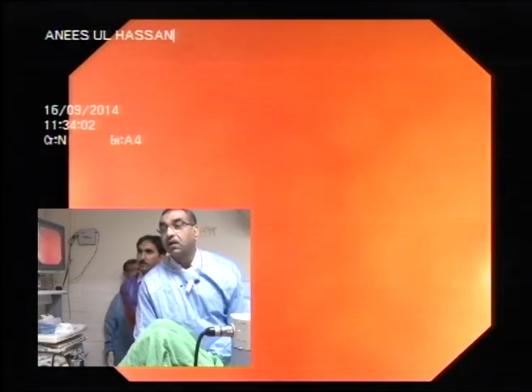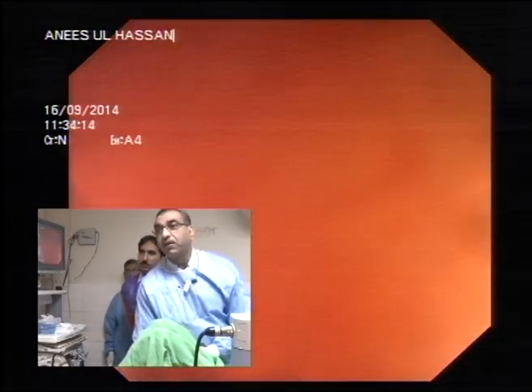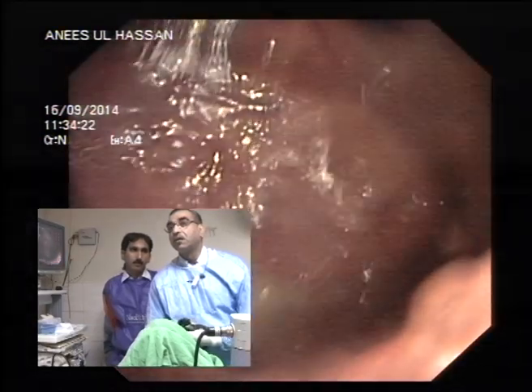But it's best done in a, it's better done in a left lateral position. लेकिन you can do it this way as well. ठीक है. तो इसमें ये होता है कि थोड़ा सा uncomfortable होता है. You have to go on the patient. तो right. Go back from there.